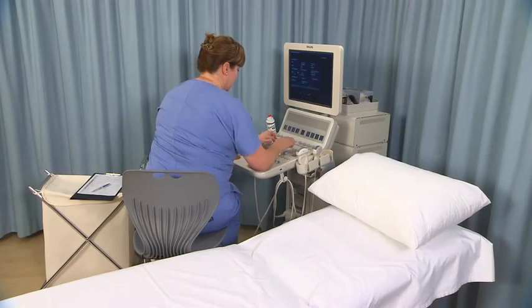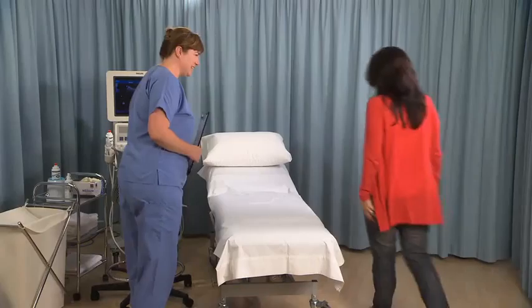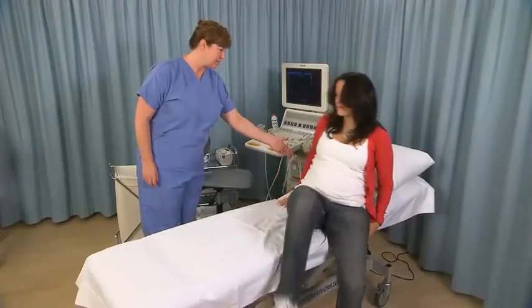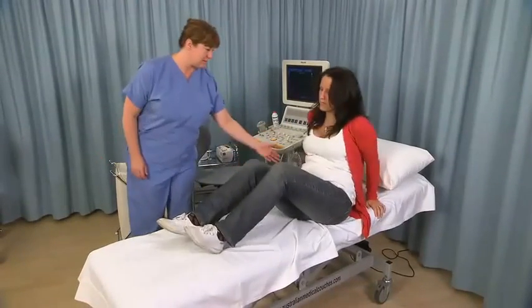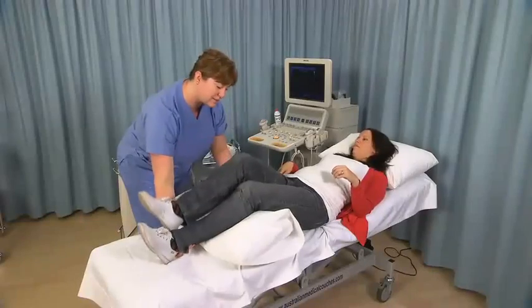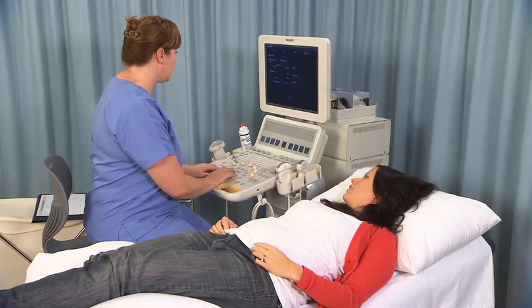Select the standard preset for second and third trimester sonography. Introduce yourself to the patient, confirm patient details and clinical information, and briefly explain the procedure to obtain verbal consent. Ask the patient to lie supine on the examination table, using pillows and foam wedges for comfort if required. Enter the patient's details and last normal menstrual period into the ultrasound machine.